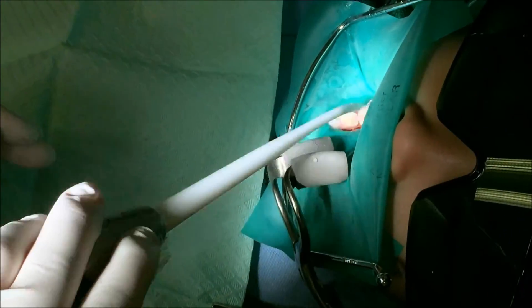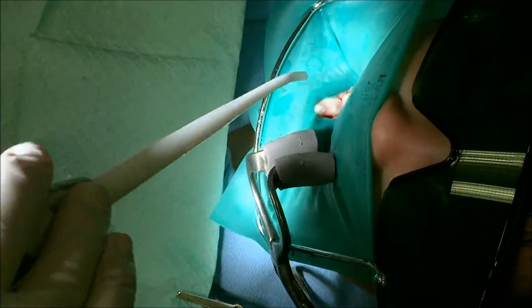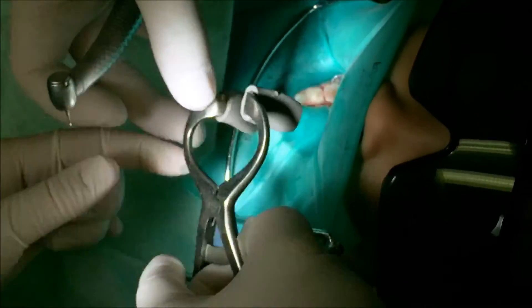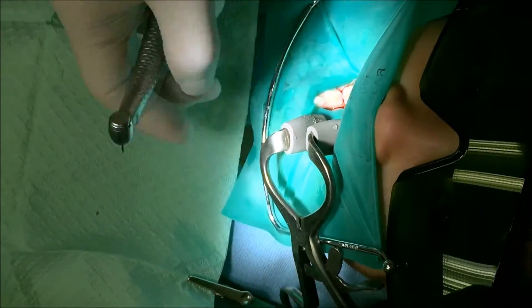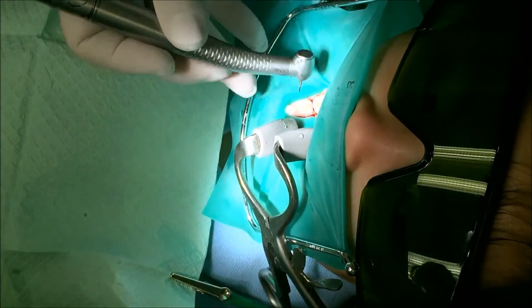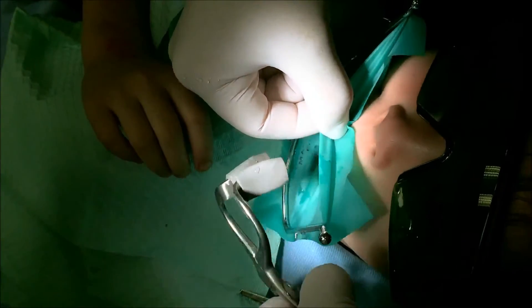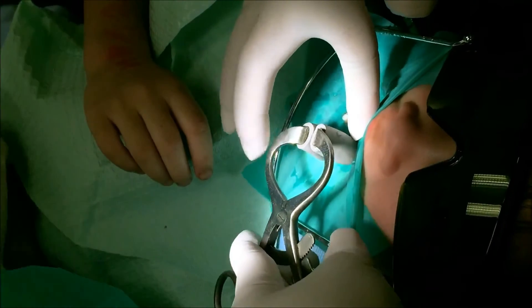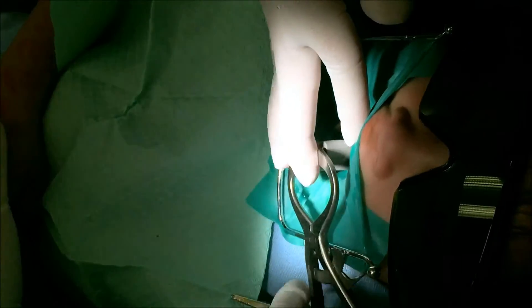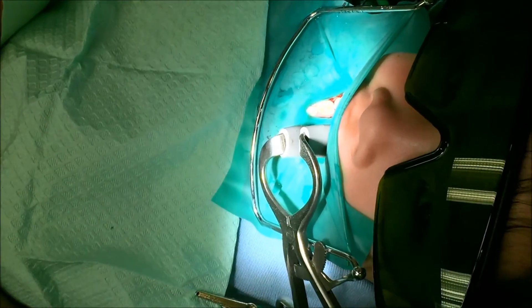Is the water getting in your eyes? Yeah? I won't use too much. We'll be done in about two minutes. Go ahead and bite down for me, sweetie. Good job. It's tickling your nose — try to bite down, then it won't come off. Open — come here, sweetie. Good job. Is that better? Yeah? Thanks for letting me know.